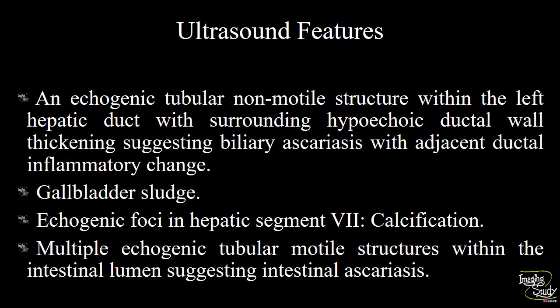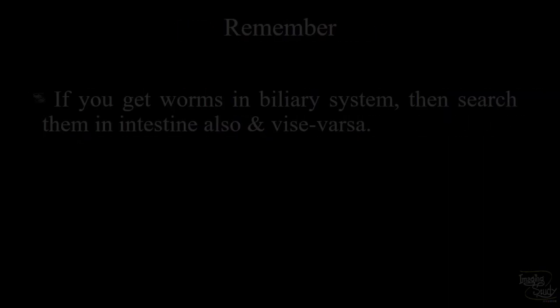In conclusion: an echogenic tubular non-motile structure within the left hepatic duct with surrounding hypoechoic ductal wall thickening suggesting inflammatory change. The gallbladder shows hypoechoic sludge. Echogenic foci in hepatic segment 7 represent hepatic calcification — which may first confuse you and cause you to stop looking for further findings. Multiple echogenic tubular motile structures in the intestinal lumen suggest intestinal ascariasis.